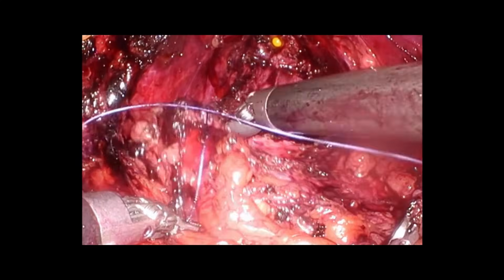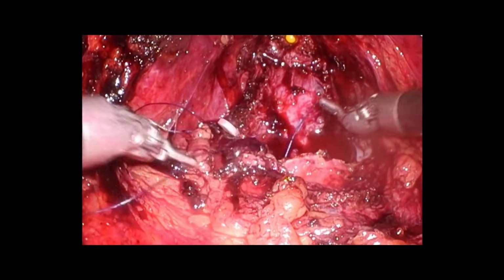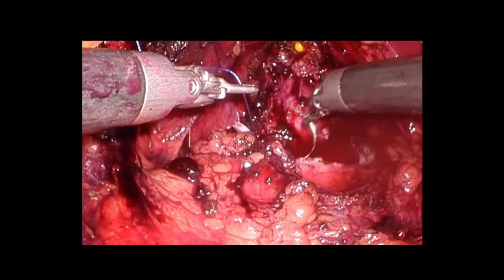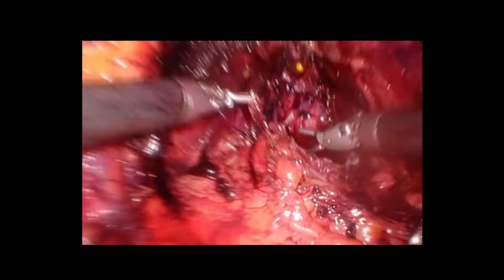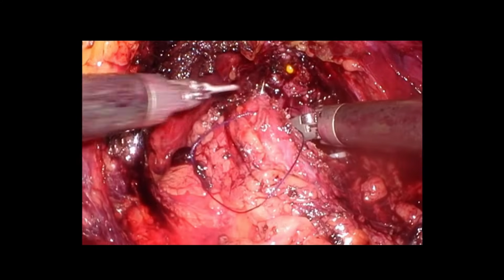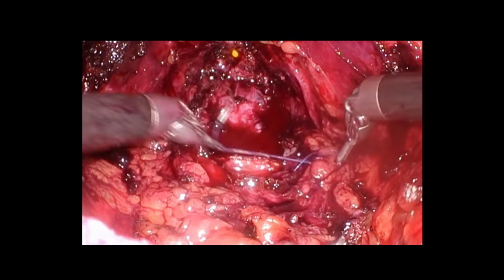Ideal is to make it almost the same or slightly bigger than the urethral caliber. That is the thing. This patient was discharged the next day, and he is fully continent after removal of the catheter on the ninth day. But the bladder neck reconstruction has to be meticulous and slightly bigger than the urethra, which is at the distal end. You can see the urethral caliber with the catheter in situ. Both sides symmetrical.